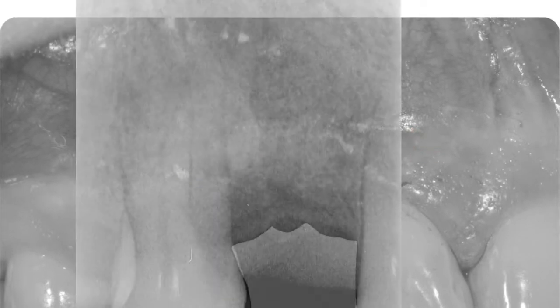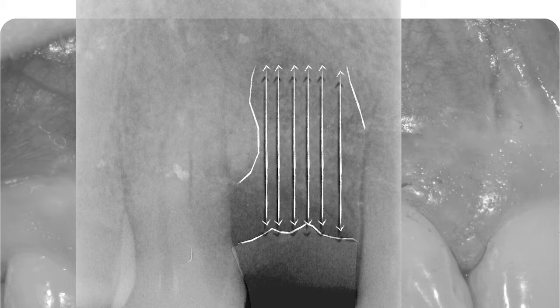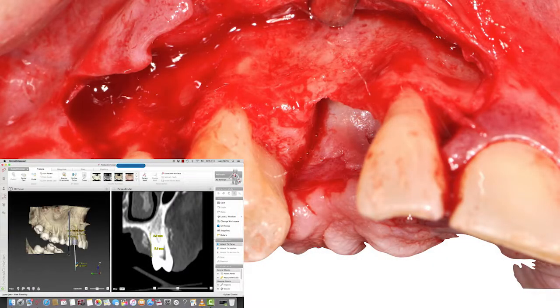Then we take a very simple periapical x-ray. We see the tremendous amount of vertical bone loss. But here we have something that is making these cases even more difficult. That is called attachment loss on the neighboring dentition. So I'm missing the periodontal ligament, which means that I'm losing 1/3 of the blood flow. So if I have to perform guided bone regeneration in these cases, and I don't have the periodontal ligament of the neighboring dentition, I get blood only from the gingiva, the periosteum, and of course from the endosteum.